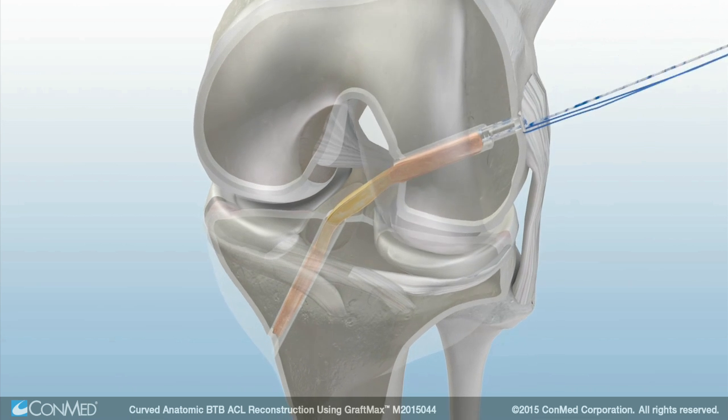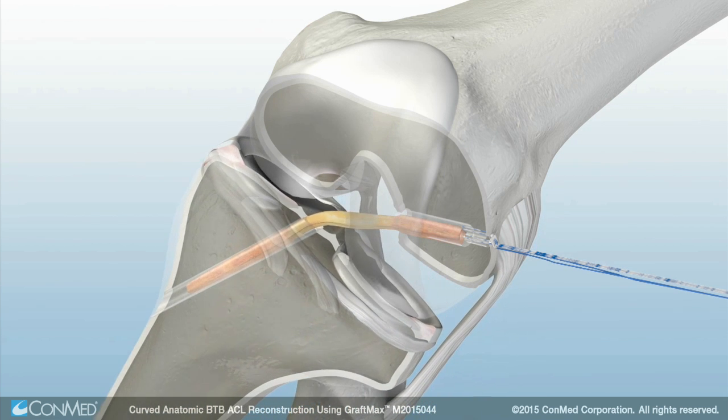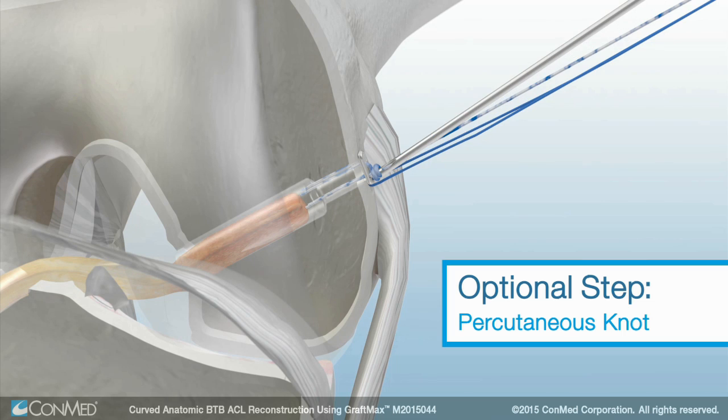Cycle the knee with tension on the graft. Then set the knee at the desired flexion angle. Tap the tibial tunnel and BTB graft. Next, insert the Genesis matrix interference screw and advance it into the tibial tunnel until flush. An arthroscopic knot pusher can be used to percutaneously tie a knot in the striped sutures over the top of the button.